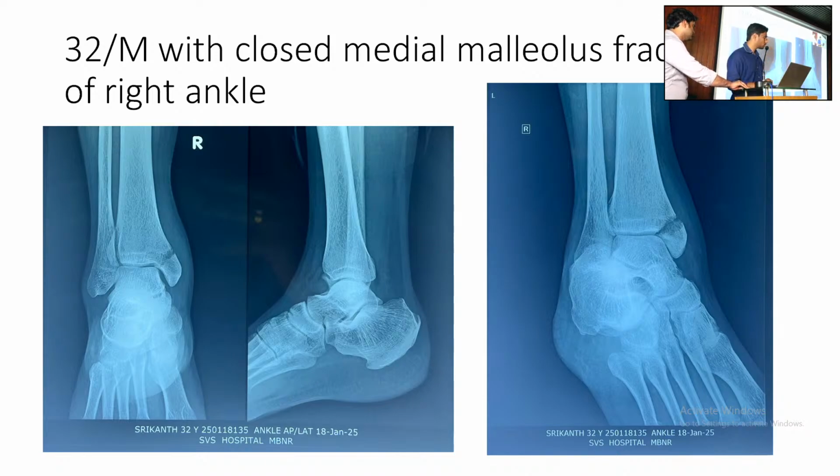Is there anything between the fracture fragments? No, sir. Nothing is there. Soft tissue interposition. That is periosteum, sir. Periosteum. Infolding of the periosteum.